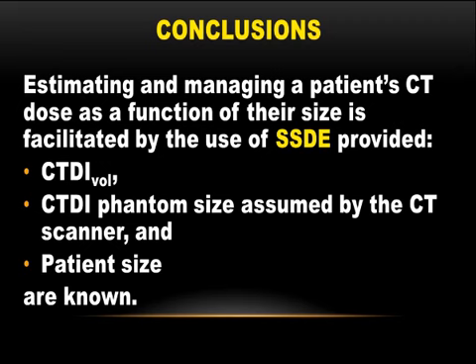So probably the better thing to do is make a measurement at the largest portion and then at the smallest portion, take the average or some weighted average of that depending upon how much time you're spending scanning those various body parts. The automated dose measuring systems do this in some automated manner, which I'm not aware of. Any idea how these Radiometrics systems handle those parts?